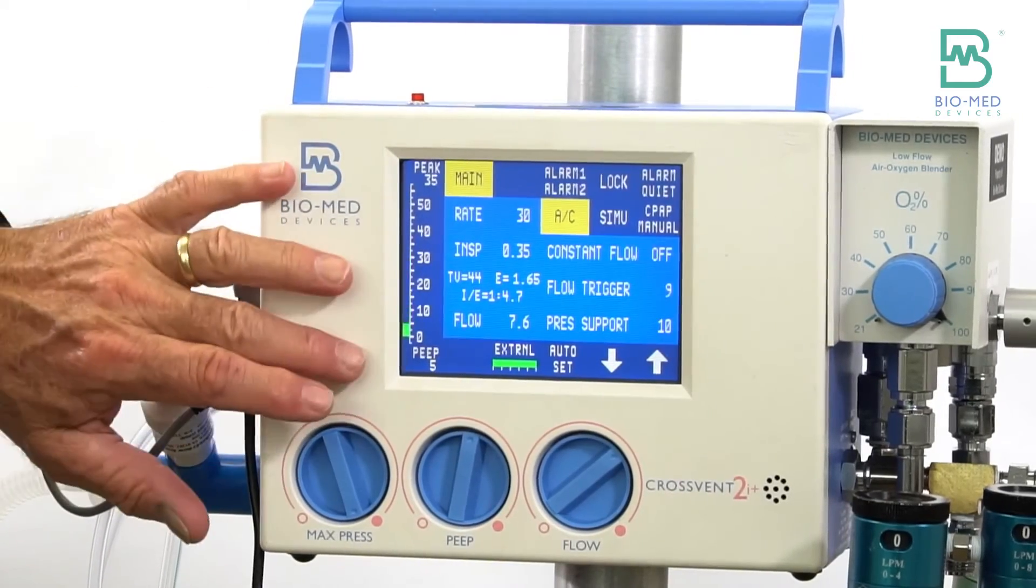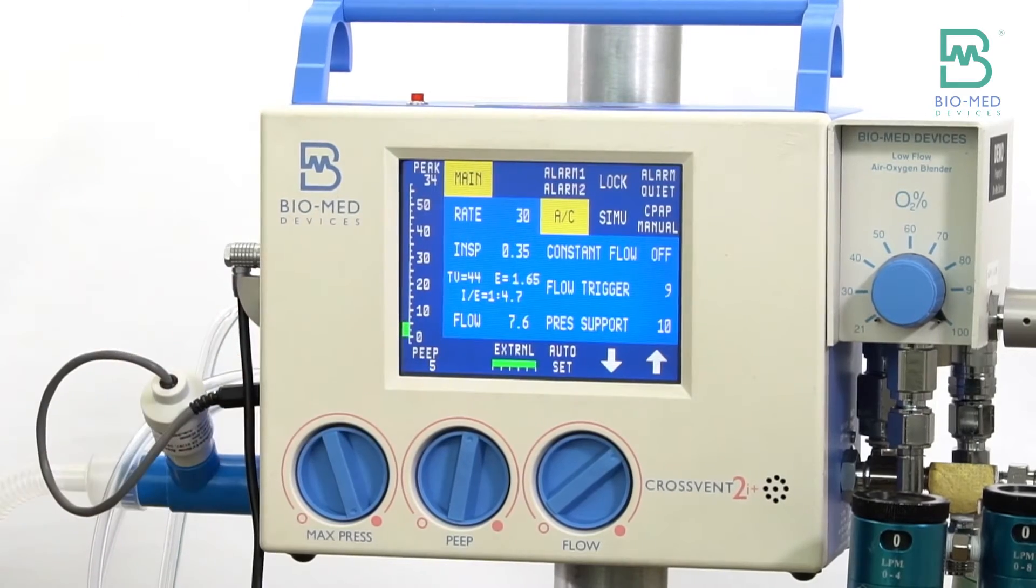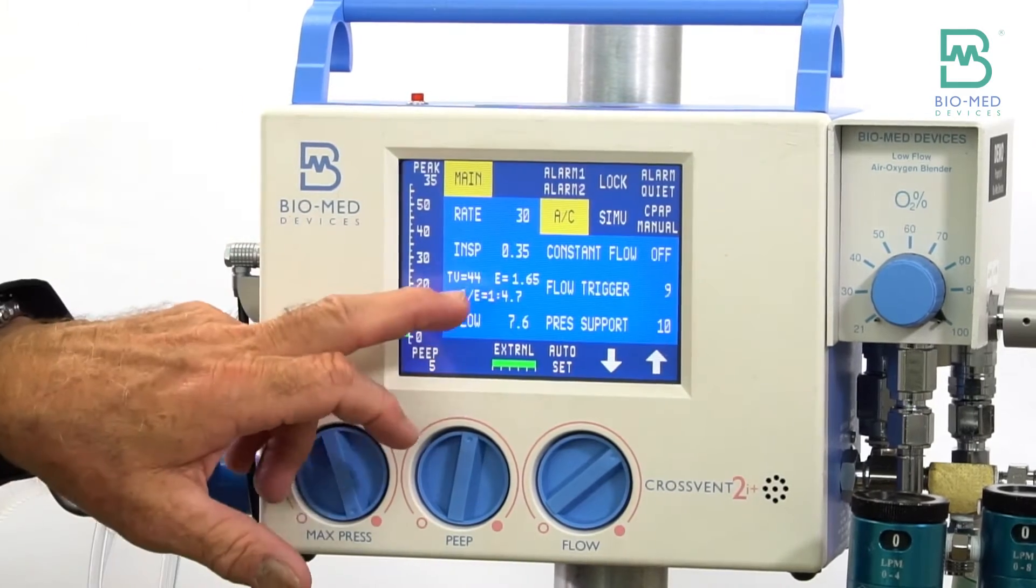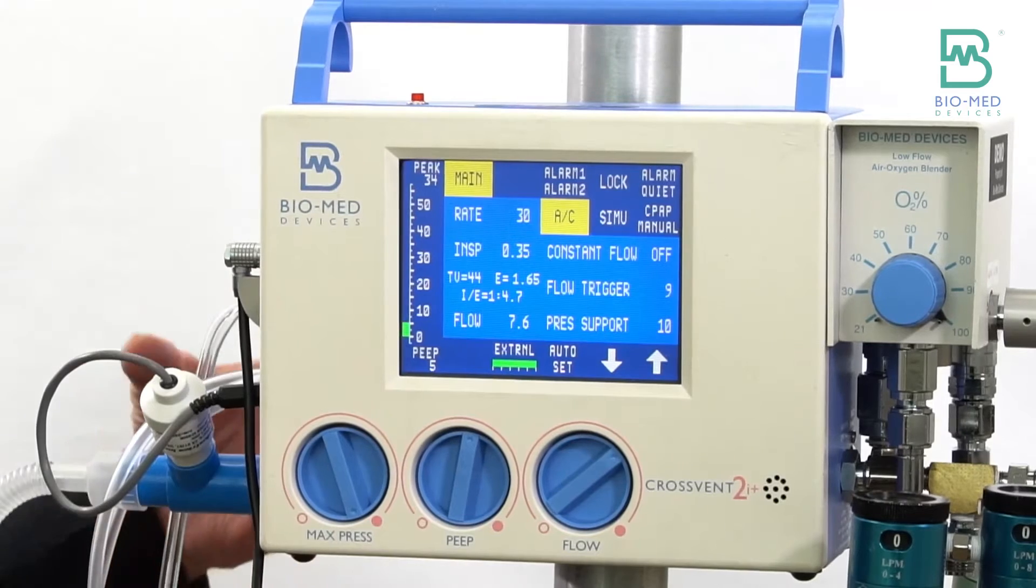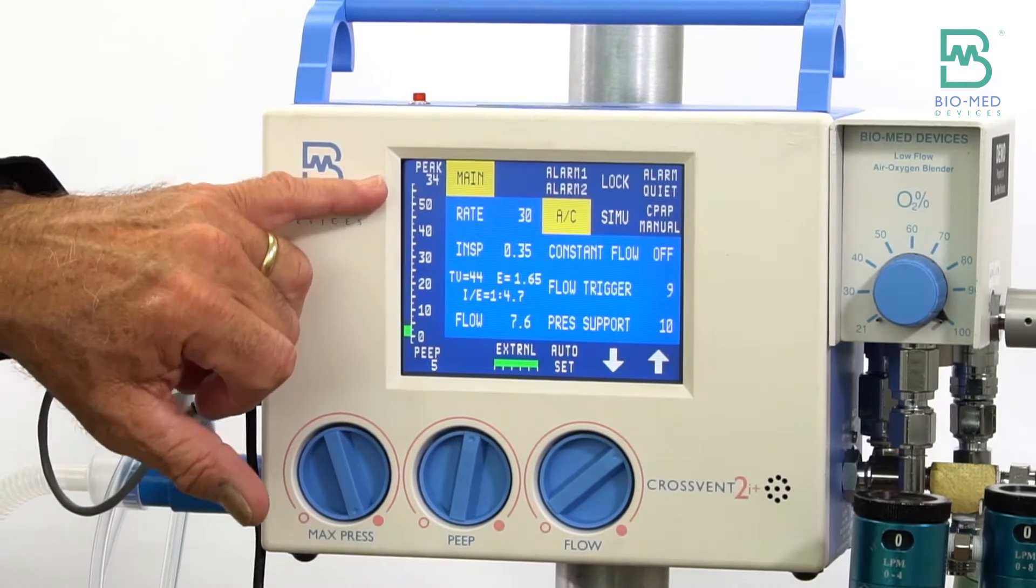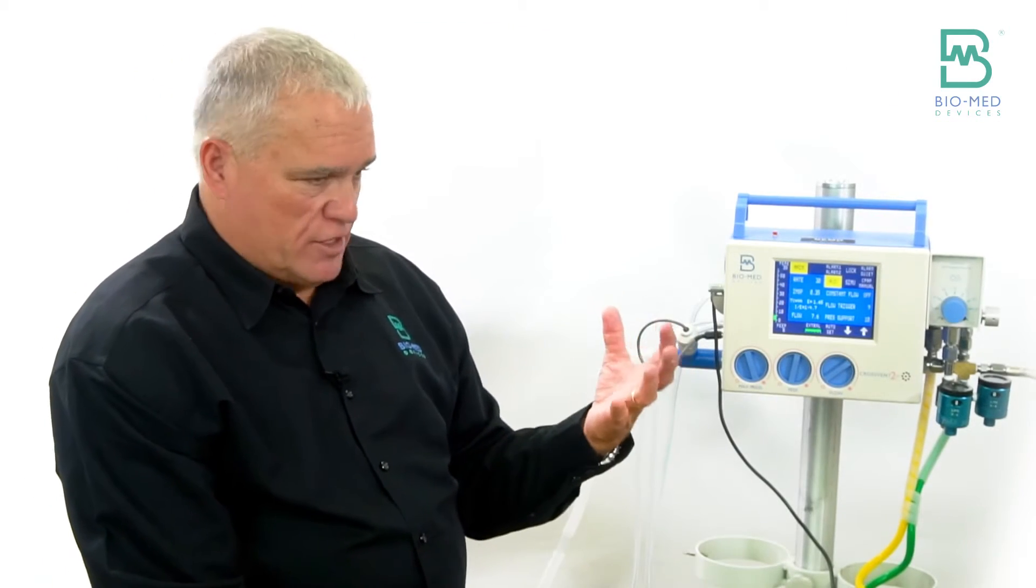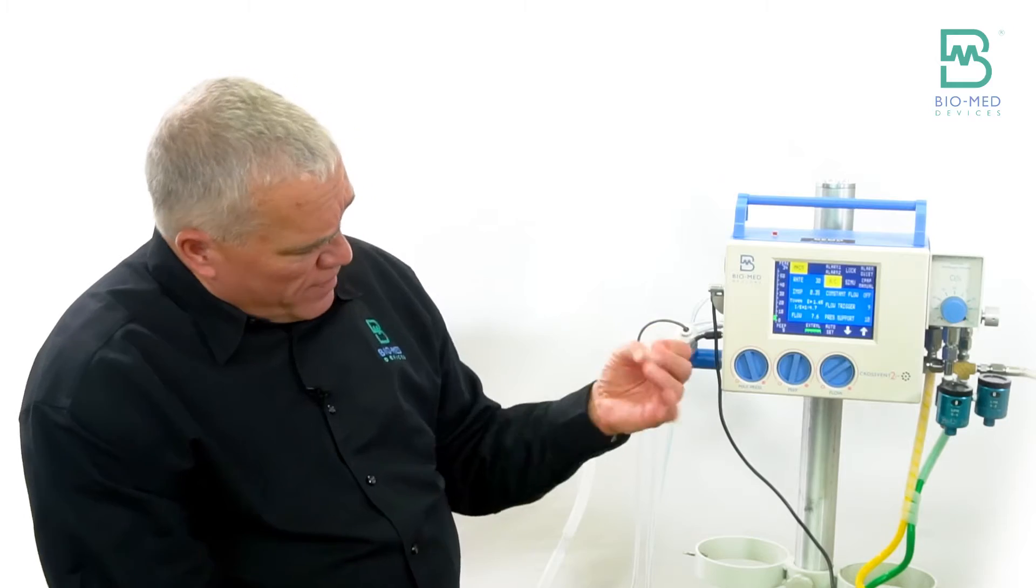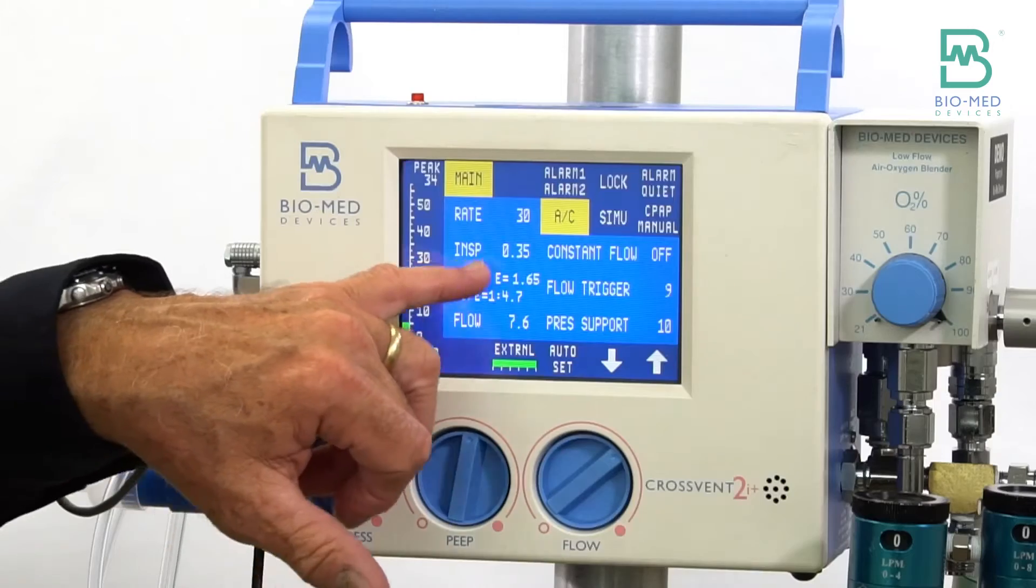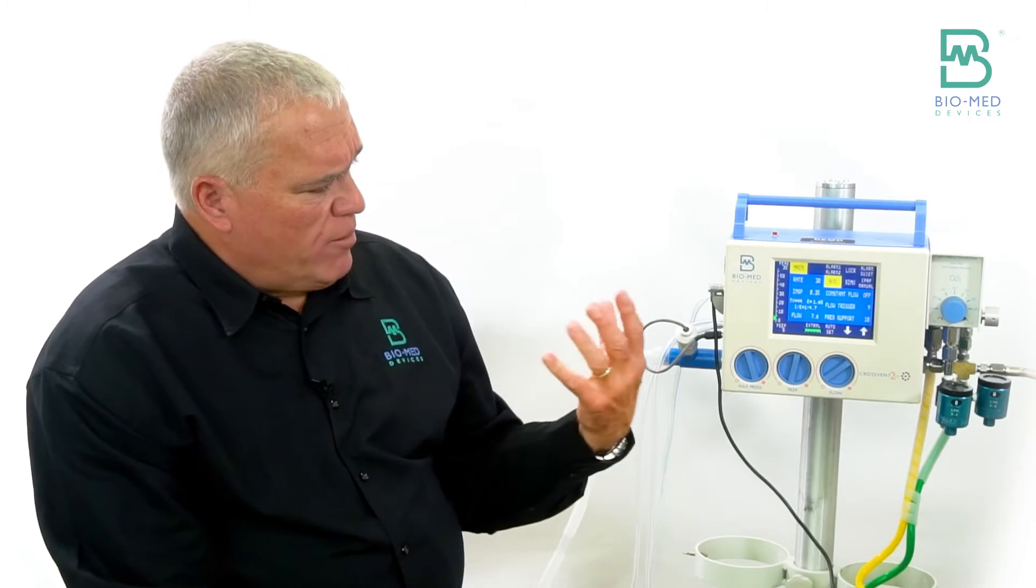So in this case it's taking me 35 centimeters of water above your PEEP to deliver that 44 through the circuit. Now again, to do the math, you take 35 centimeters minus your PEEP, so that's 30 centimeters. If my compliance factor is 0.5, that means that about 15ml of that volume is going to be lost, so that would mean I would expect about 29.